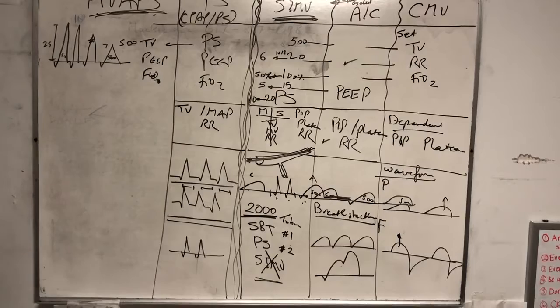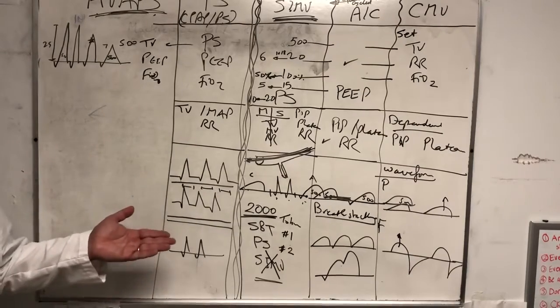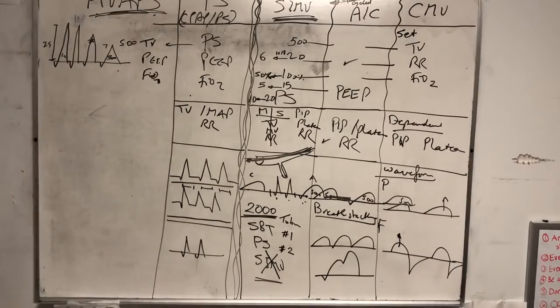So that's why these modes of ventilation are coming stronger now, because they want to see the patient walking with an endotracheal tube. Huh? And you're not going to walk somebody with an endotracheal tube on volume control. That'd be like suicide, you know, and you don't want to do it because he's not going to tolerate it. So you give him the simplest mode of ventilation, either this or that, right?